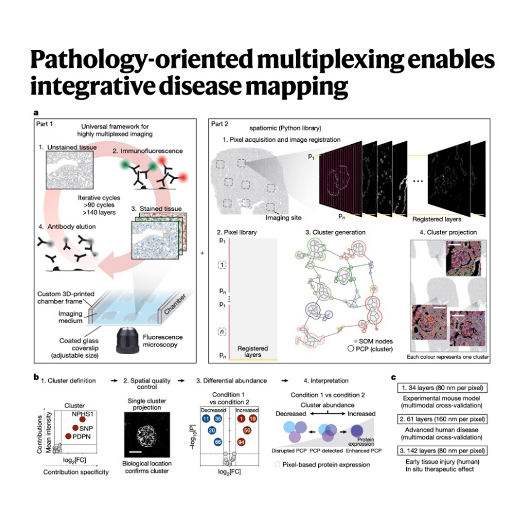Okay, proof of mechanism in a dish. Did it translate to humans? That was step 2. Cross-species validation. They used PathoPlex on actual human kidney biopsy samples from patients with CGN. And they found PECs that were positive for both PJUN and another marker of activation, CD44. Yeah. These activated PJUN-positive PECs were found exclusively within the crescentic lesions in the human samples. It directly linked the cluster 21 signature found in mice to the actual human pathology.